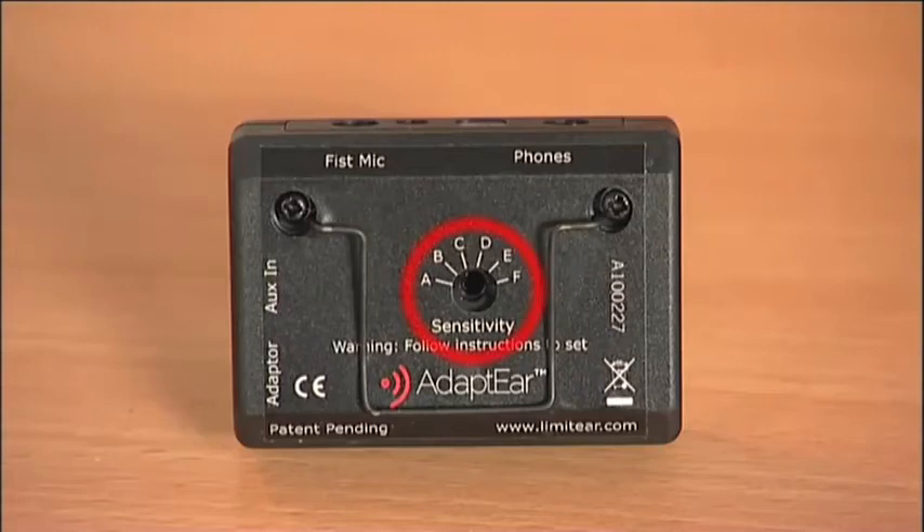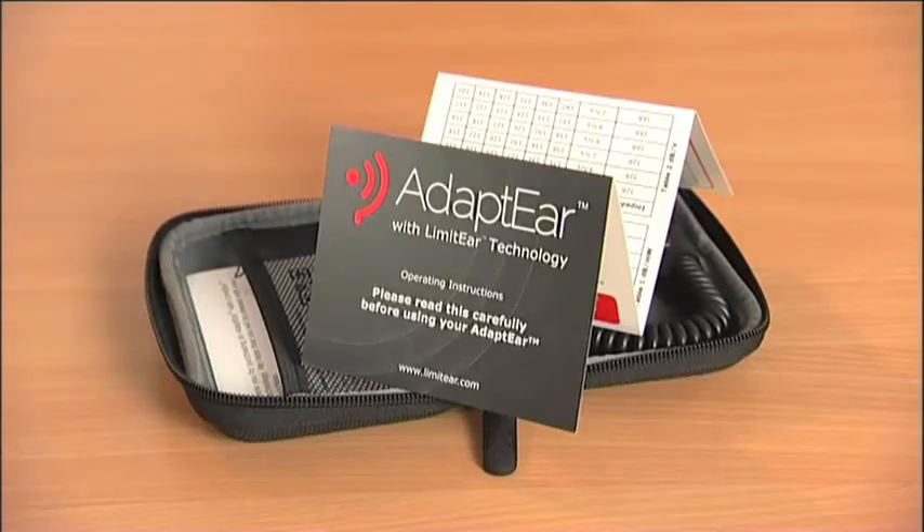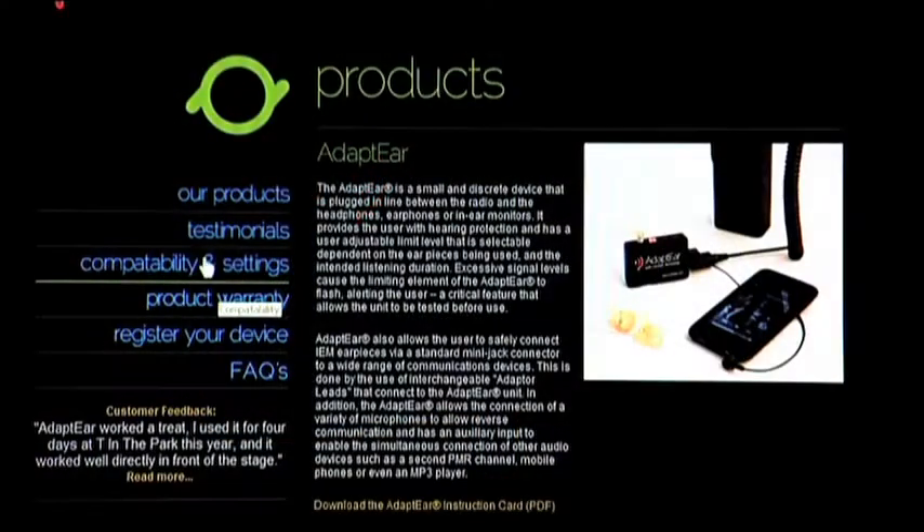Before use, Adapt Ear should be set to the sensitivity of your earpieces. For setting information, please refer to the operating instructions that came with the Adapt Ear, or visit our website.